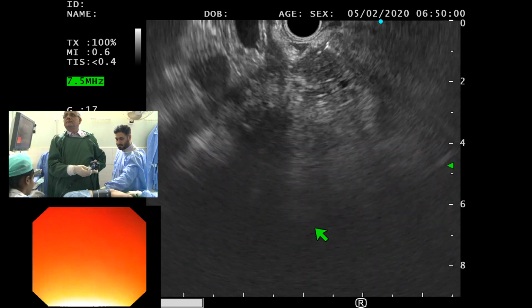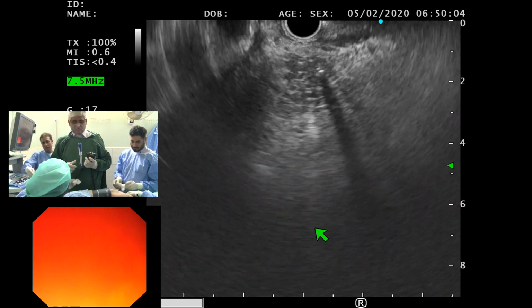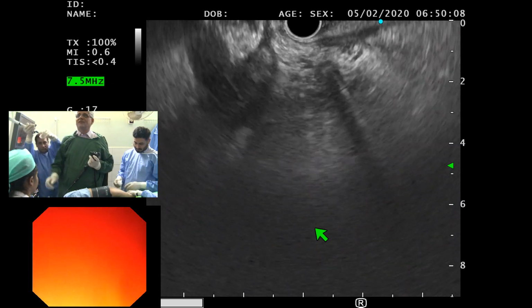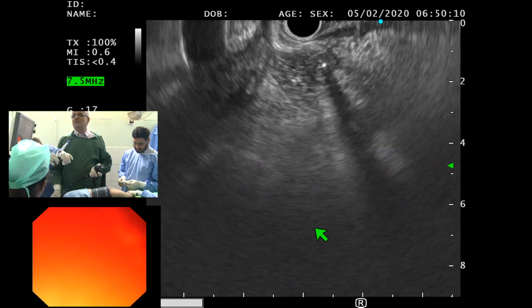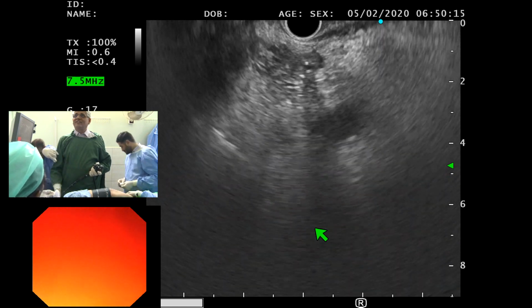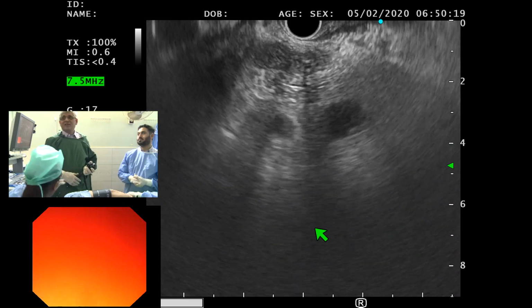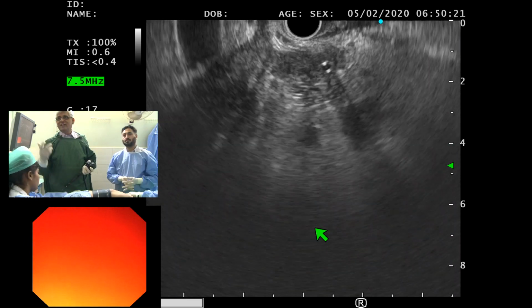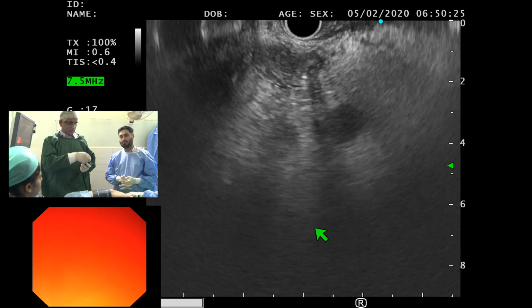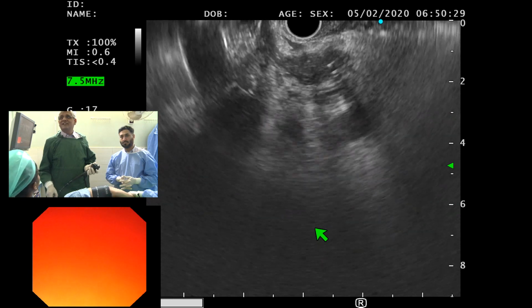Sir, this is your third pass. Yeah. Would you have used suction in this case? No, I have not had any feedback so far from the colleagues, but I know in this case I would certainly need 3 passes anyway. So I went ahead with 3 passes and now I'll stop. That's our own experience. I don't think in a lesion like this my support staff will be satisfied with anything less than 3 passes.